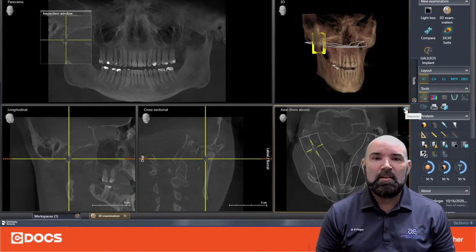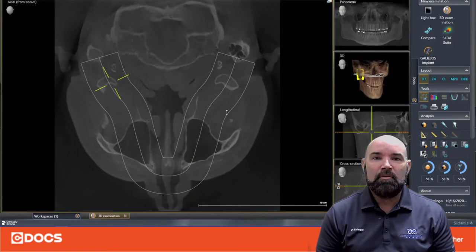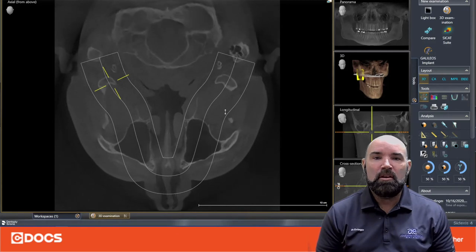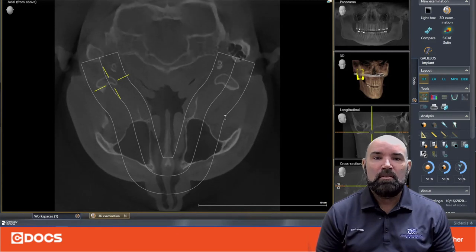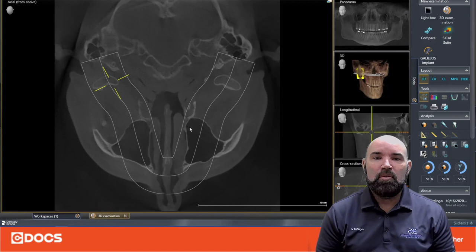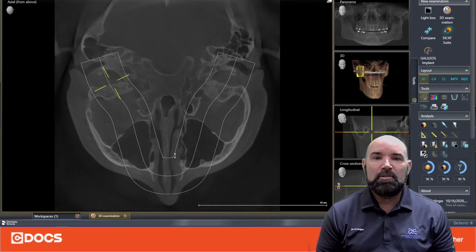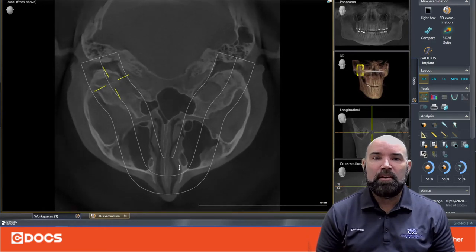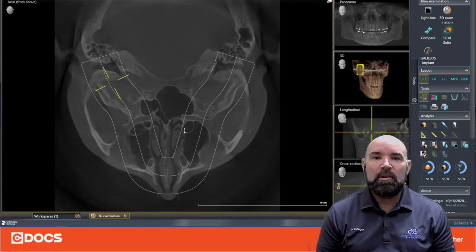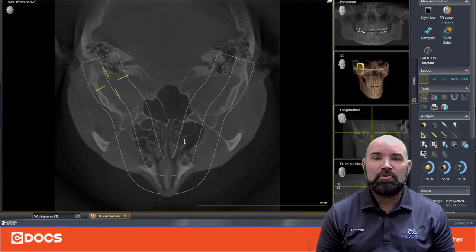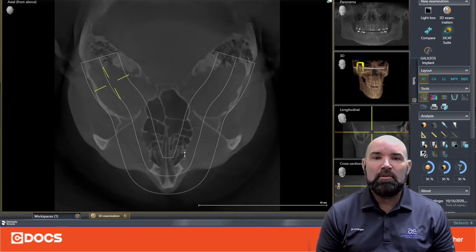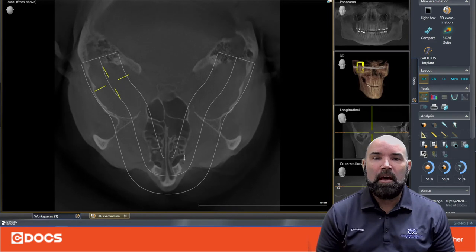The other nice thing about Axios is we get a full-volume scan — a complete visualization of the paranasal sinus structures. What I'm doing here is I'm in our axial view, looking at the nasal septum and the maxillary sinuses. With this large field of view, we have a very nice image and full visualization of our structures. We're looking now at the sphenoid and ethmoid sinuses.